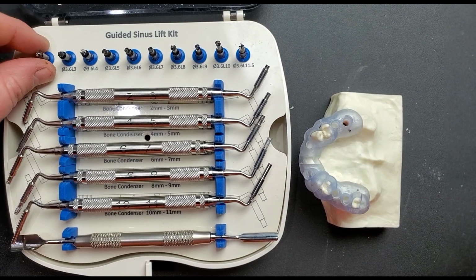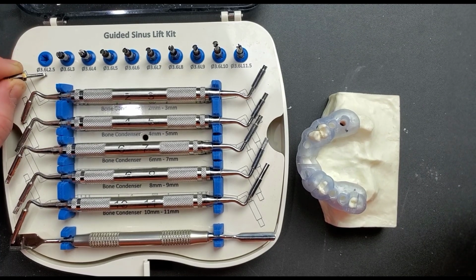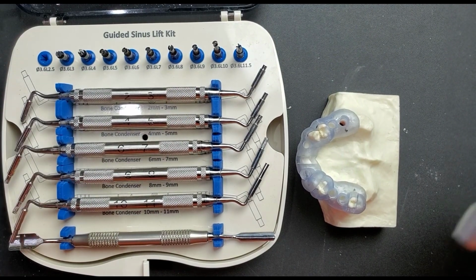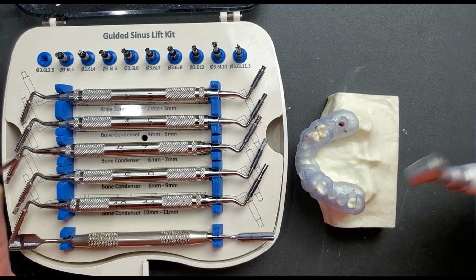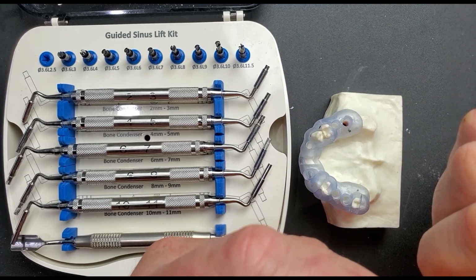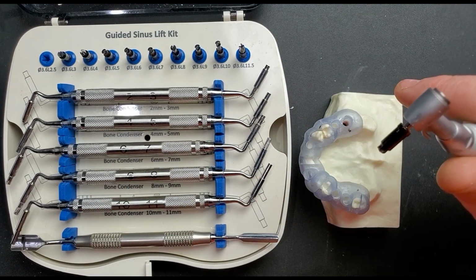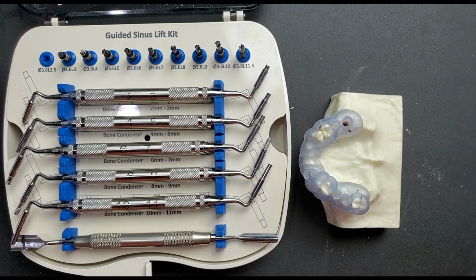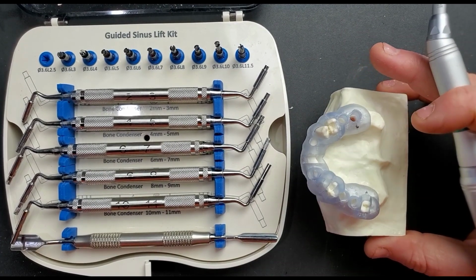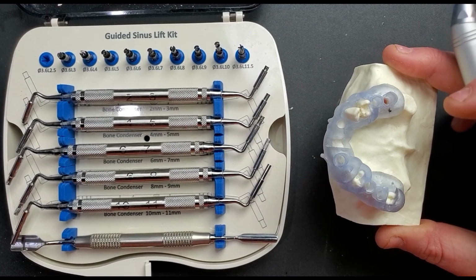So I'm going to grab the very first drill in the kit, which is in the upper left corner. This is a 3.6 by 2.5 in length. And it's also worth noting all of these drills are 3.6 in diameter. Unlike the old kit where they got sequentially bigger, all of these are going to be 3.6 in diameter. The reason for that is because 3.6 is an ideal sized hole to be able to introduce your graft material and elevate the membrane, but it's not such a large hole that you're going to have difficulty getting primary stability. Generally, if you're doing a sinus lift, you're probably going to be placing a 4.0 or larger implant, in which case a 3.6 osteotomy is going to be ideal.